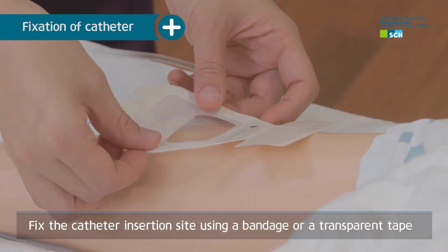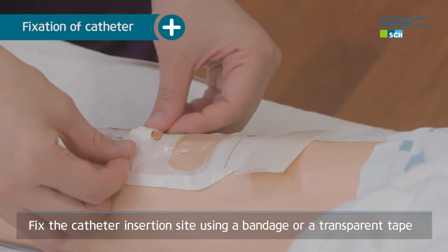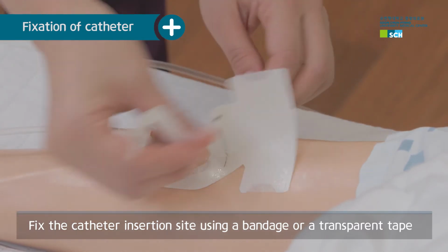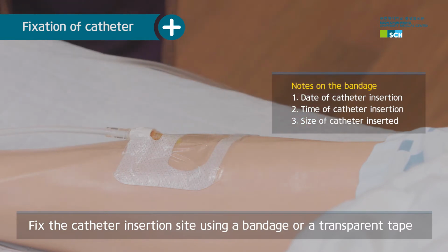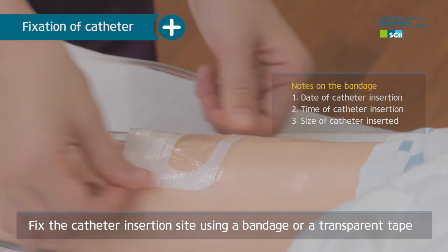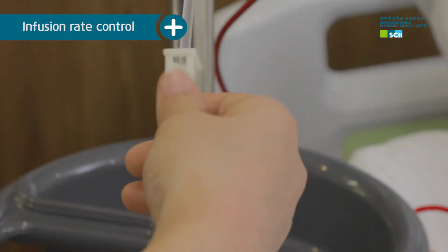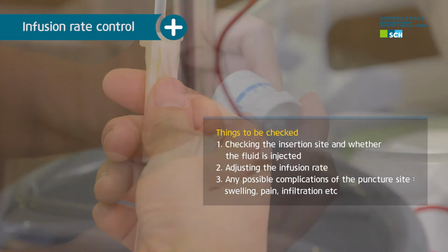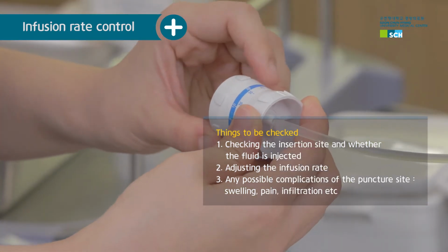Fix the catheter insertion site using a bandage or a transparent tape so that the inserted site is not bent. Write the date and time of insertion and the size of the catheter on the fixed bandage. Release the roller clamp of the fluid set to check whether the fluid is injected and observe patient and any possible complications of the puncture site.